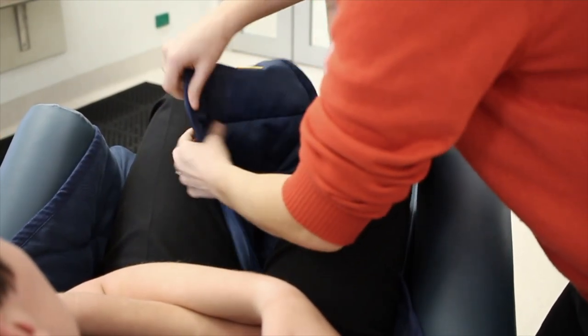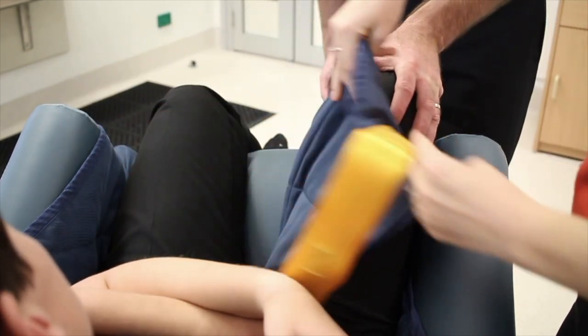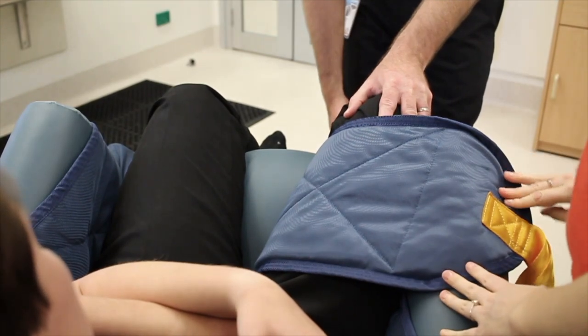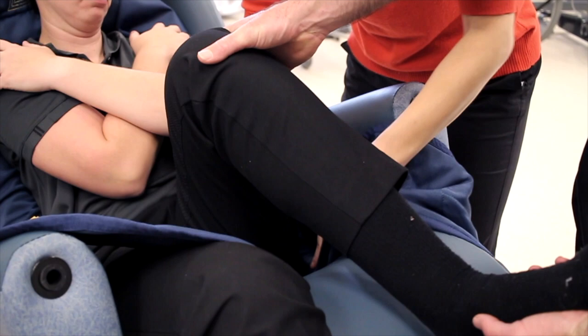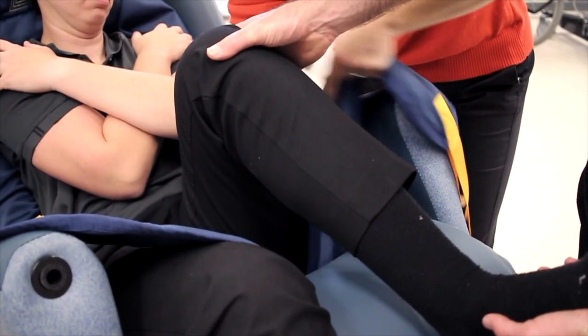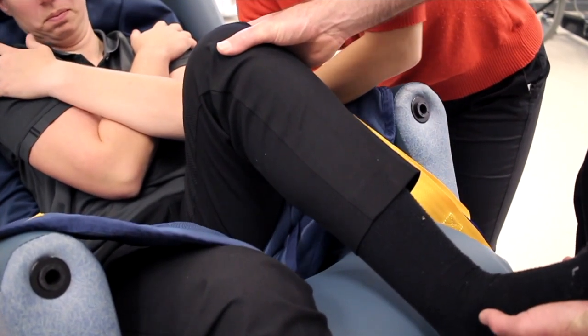The strap is then folded back over the inner thigh to ensure that the straps are out of the way. You can see on this side that we're doing the same thing from a different angle, just to show how we position and tuck the leg strap to avoid any risk of skin tears with the therapist or staff member's hand as they position the leg strap.